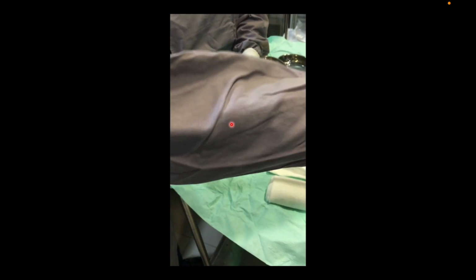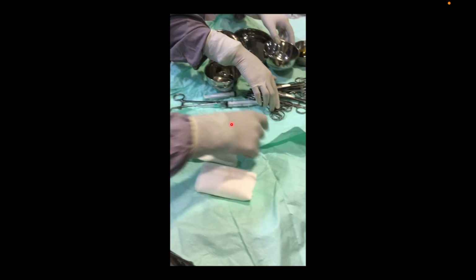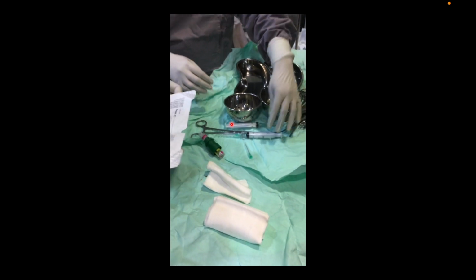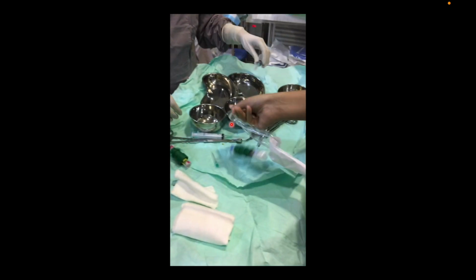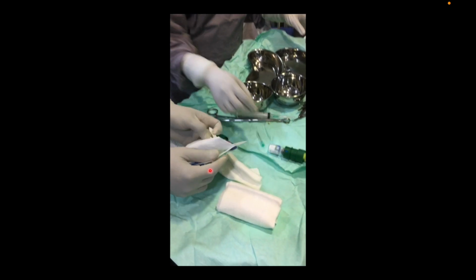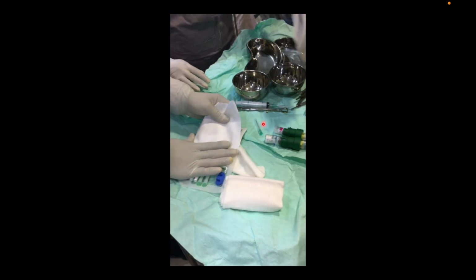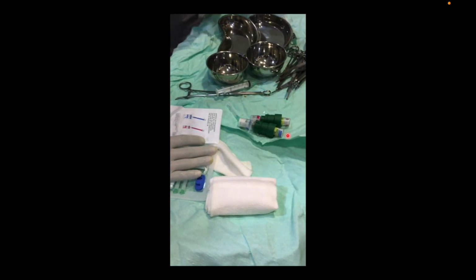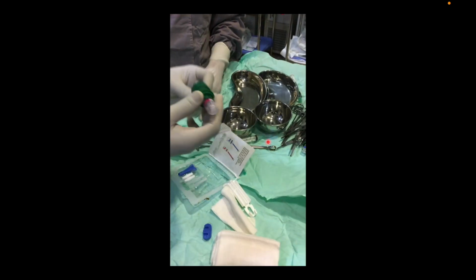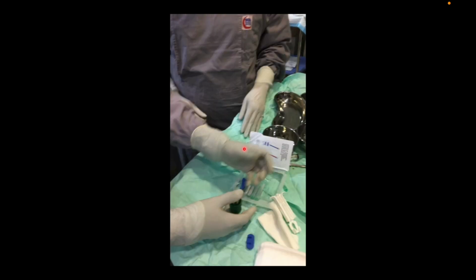So this is a case which I did in Trauma Center Karachi with an interventional radiologist, Dr. Irfan Lutfi. So here you can see that this is the pack in which thrombin and fibrin come. The red one is the thrombin and the blue one is the fibrin, and they usually come with two bottles connected to each other.